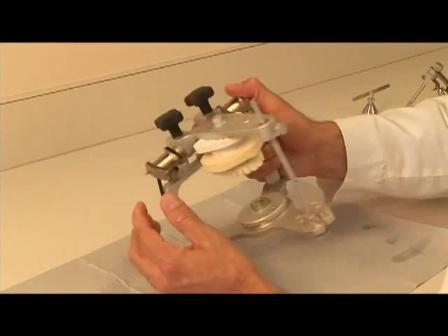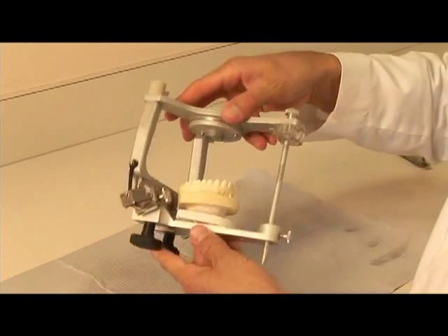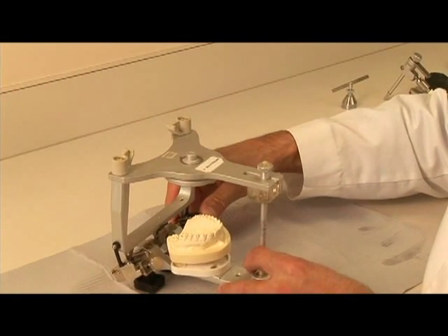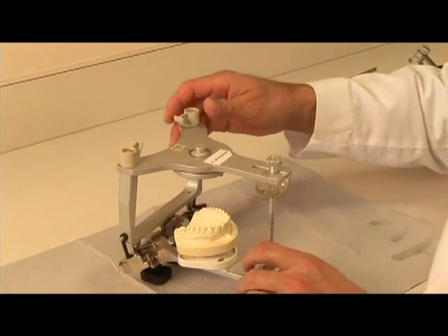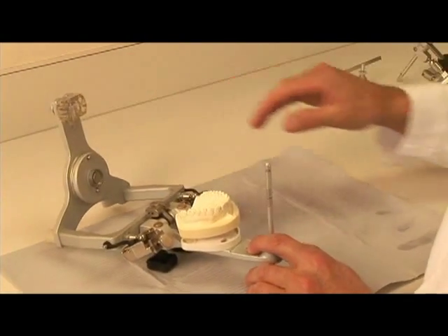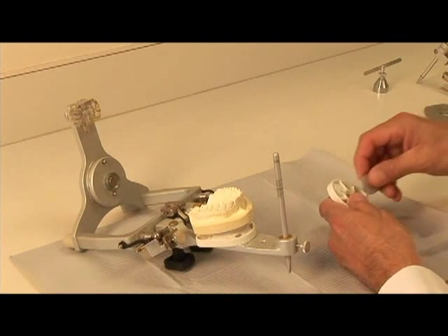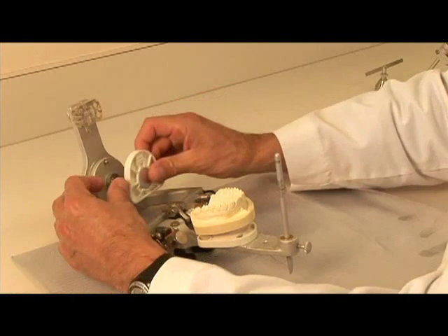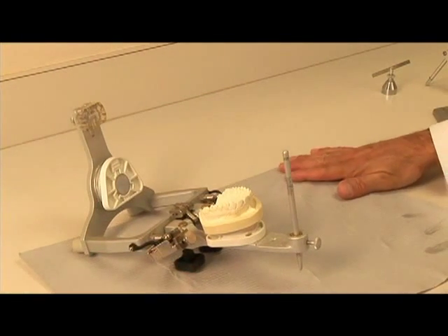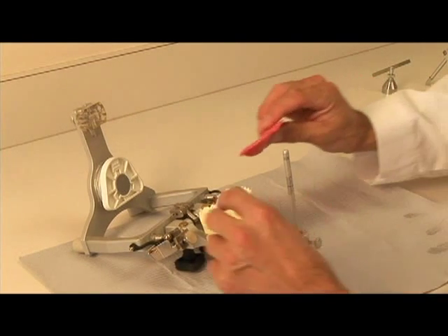After the mounting stone on the maxillary cast has set, we can then proceed with mounting the mandibular cast. Invert the articulator. The articulator will be supported by the black knobs on top and the incisal guide pin. Open the articulator and place a mounting plate on the lower member of the articulator as shown. Inspect both maxillary and mandibular casts for nodules or other interferences. If interferences are present, remove them, being careful not to change the occlusal relationship.